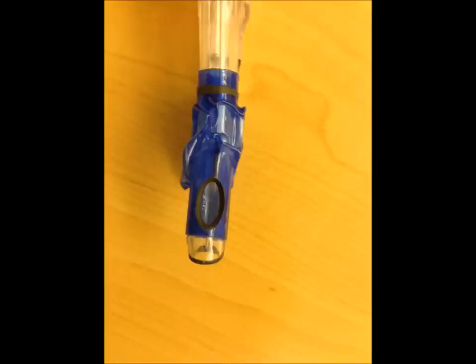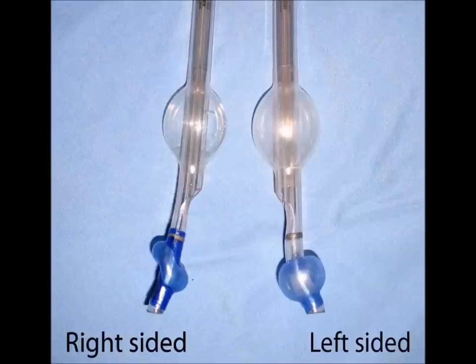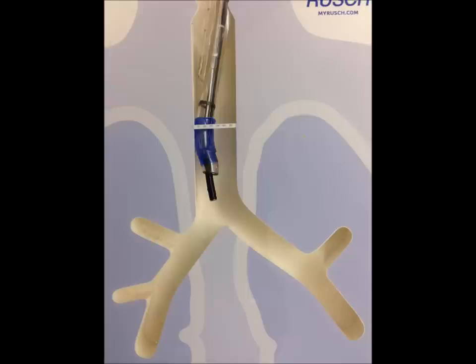Therefore, most doctors now are using exclusively the left endobronchial tube, which here's a picture of that. Much smaller cuff, and it has a nice angle where it fits comfortably in the longer left bronchus, with less chance of moving too far distally. Here are the two tubes next to each other. They both have tracheal cuffs. Always the tracheal port comes off medially here, and then here's the regular round left endobronchial cuff that we use often.